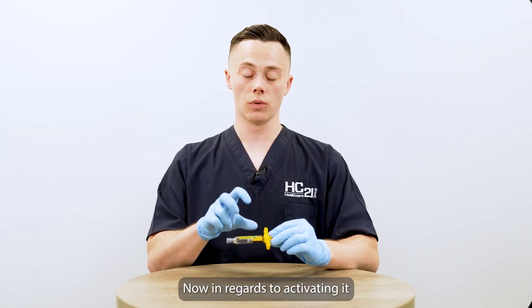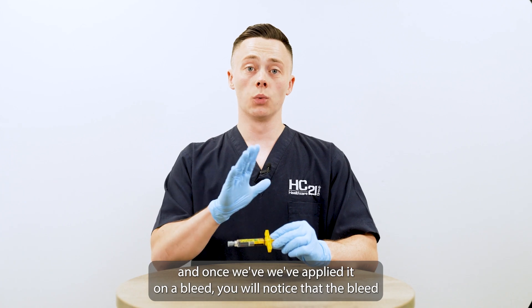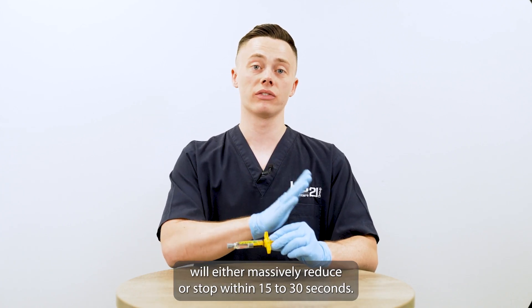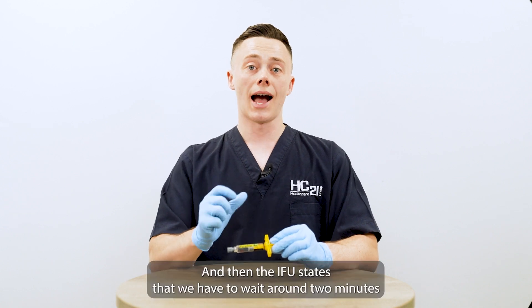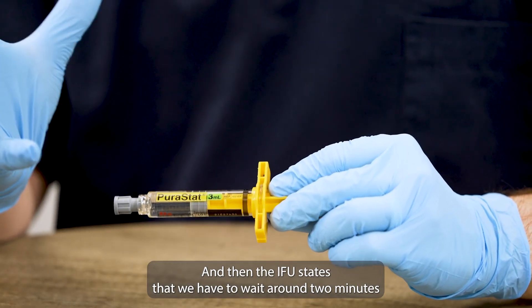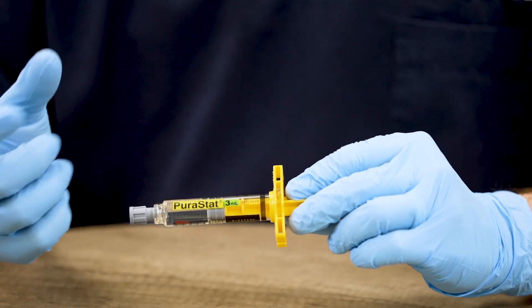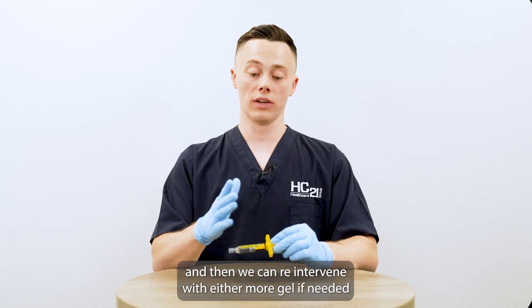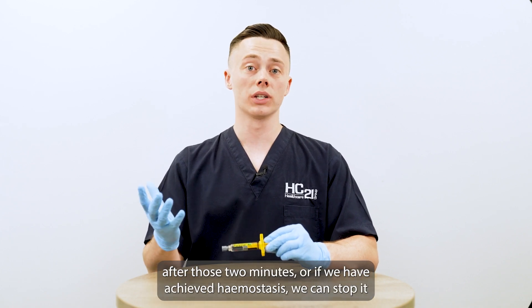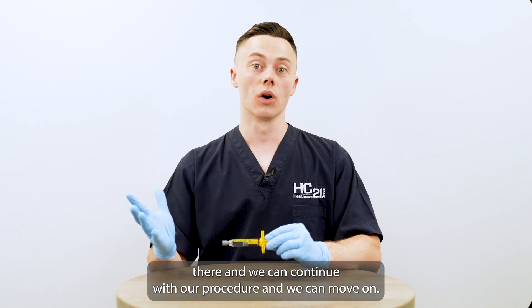In regards to activating it and once we've applied it on a bleed, you will notice that the bleed will either massively reduce or stop within 15 to 30 seconds. The IFU states that we have to wait around two minutes for it to fully work. Then we can re-intervene with either more gel if needed after those two minutes, or if we have achieved haemostasis, we can stop there and continue with our procedure and move on.